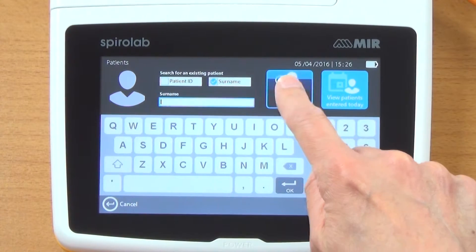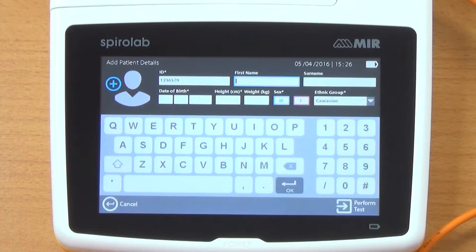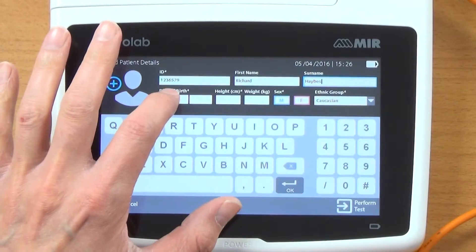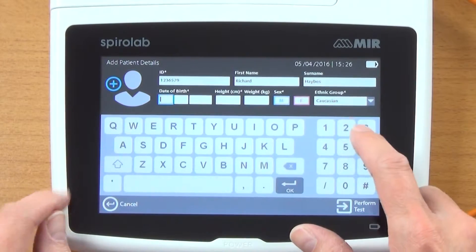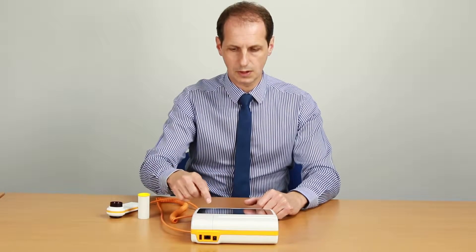I'm just going to pop my details in — add new patient. So the ID number, I'll just put in any number, first name, surname. You can see it's got a nice QWERTY keyboard on the screen. Pop my date of birth in, and it moves along through each box as you're entering details.